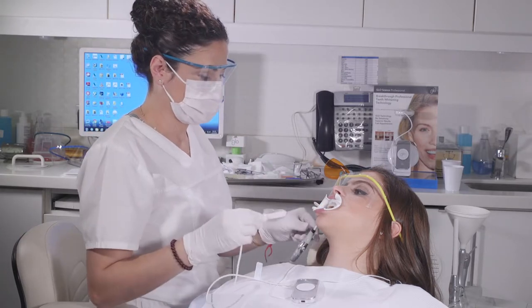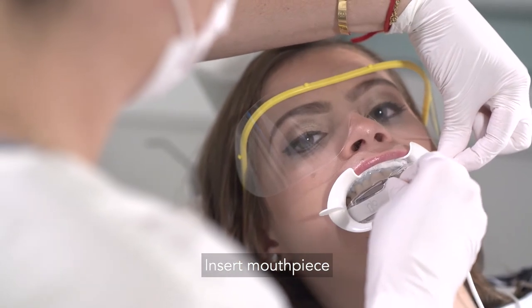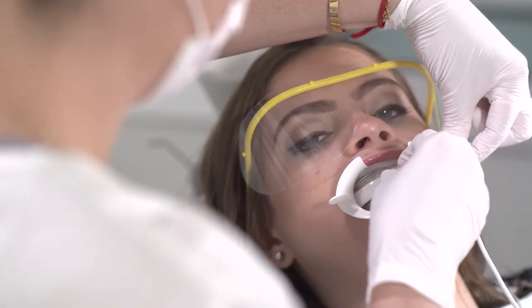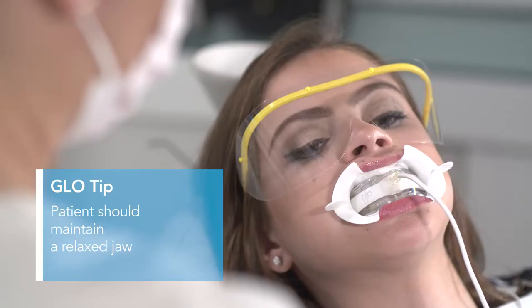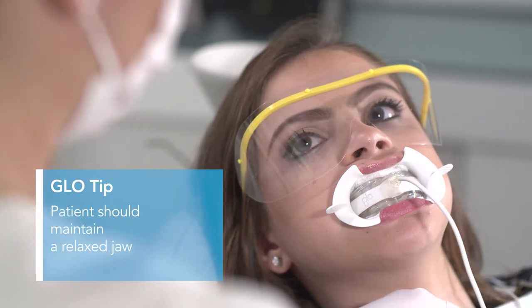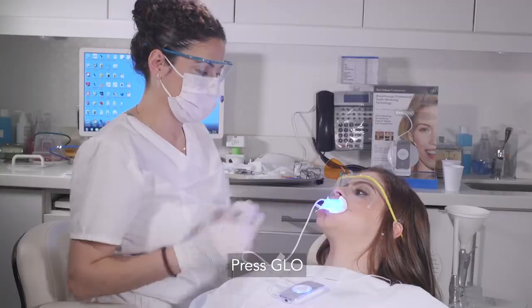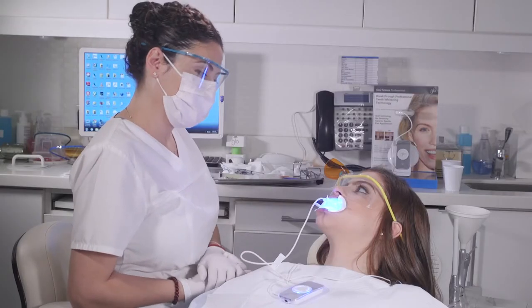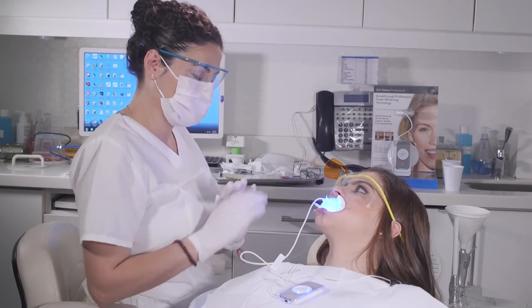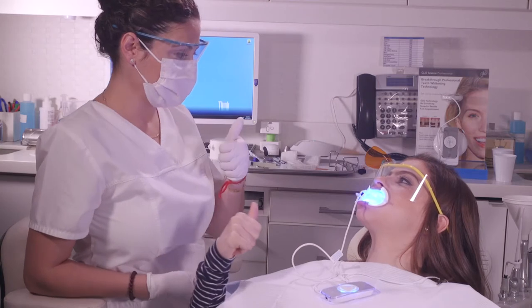Instruct the patient to open slightly and insert the Glow Universal mouthpiece. They do not need to open wide, as this could disturb the gingival barrier placement. Have the patient bite down lightly on the mouthpiece but maintain a relaxed and comfortable jaw. Press the Glow button on the control and your patient is now glowing. Check in with your patient about halfway through the application — a simple thumbs up or down will do it.